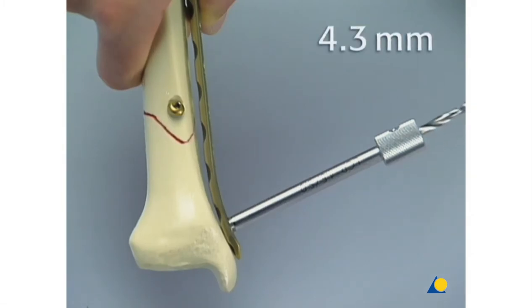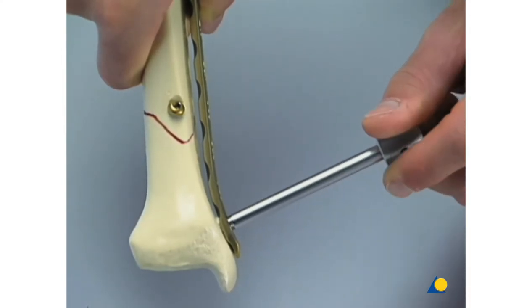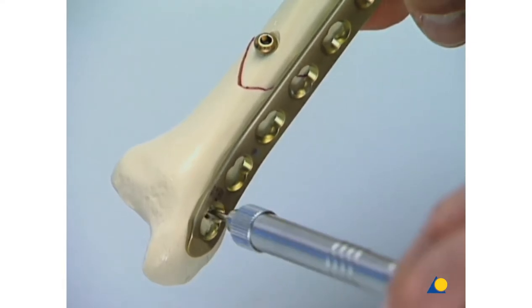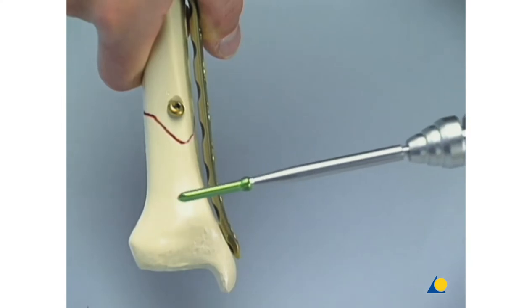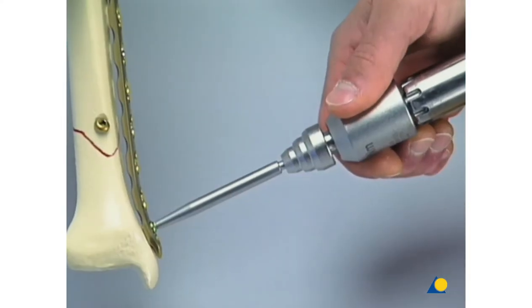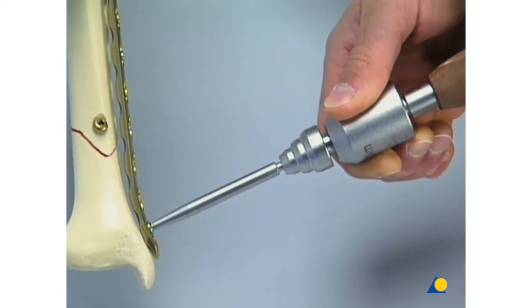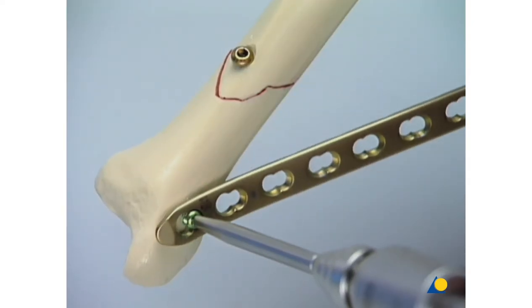The most distal hole is drilled with the 4.3 millimeter drill bit through the drill sleeve that has served as an insertion handle. The drill sleeve is removed, and the length is measured with the depth gauge. The green self-tapping locking head screw is inserted with the torque-limiting screwdriver attached to the power drive. The last turns have to be done by hand to prevent the thread from jamming, so the power drill is exchanged for the handle of the screwdriver. At this point, if the other end of the plate is not well secured, the helicopter effect will be created.